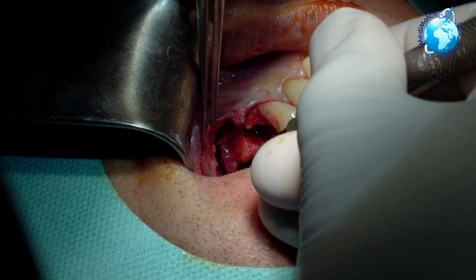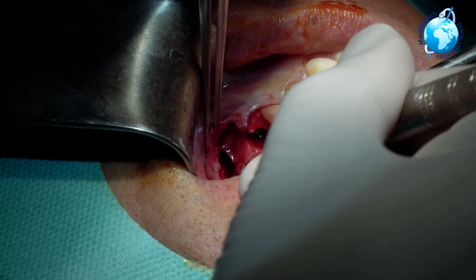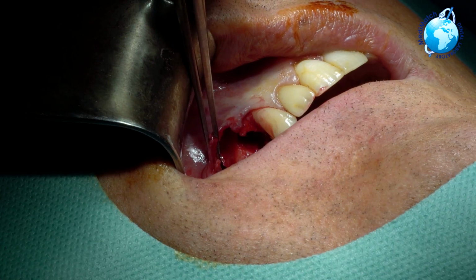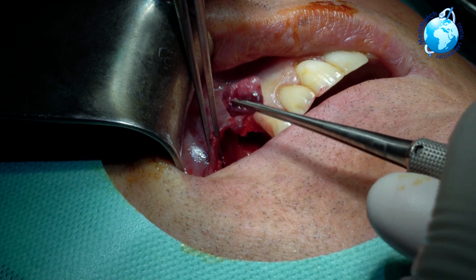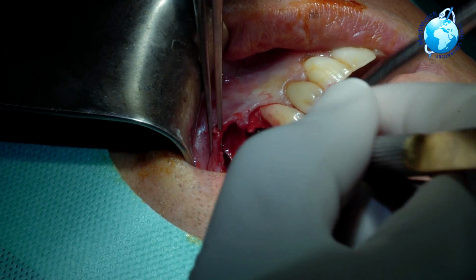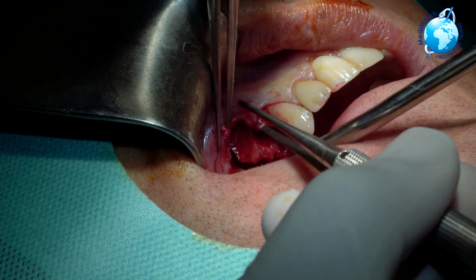So it's really important to remove this infection, especially when we're placing implants. And you can see we've got it nicely enucleated in one go, and you can see it's epithelial-lined, probably what is a dentigerous cyst. There, can you see that on the camera? Yeah. And that cyst is all removed now, and we can now really visualize the remaining bone structure as well as the width of the ridge and the socket anatomy.